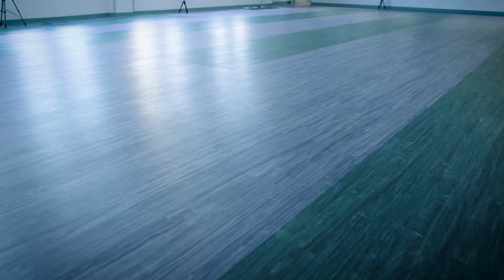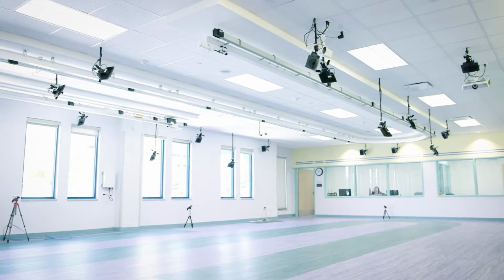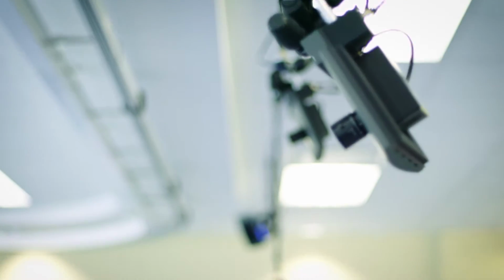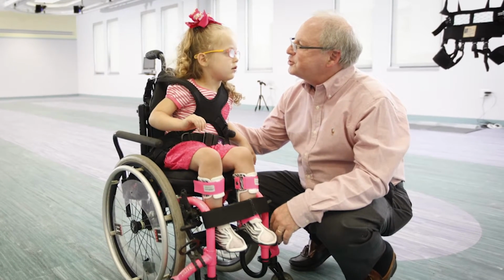Motion Lab uses a computer to combine data or information from different body parts. Most gait labs are directed by orthopedists. Because I've always had this interest, especially in upper extremity function, I just thought there was so much more these labs can do. So typically a motion lab is focused on children with a diagnosis of cerebral palsy.